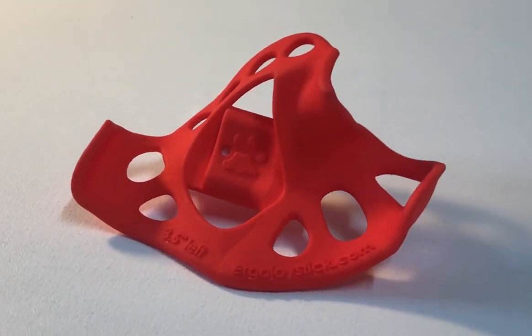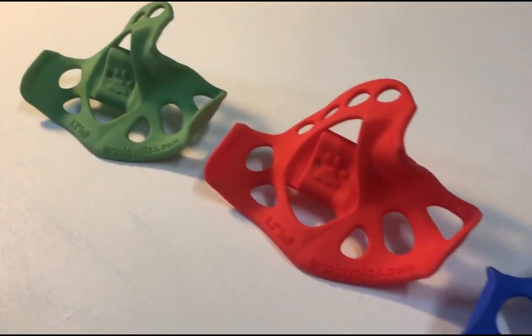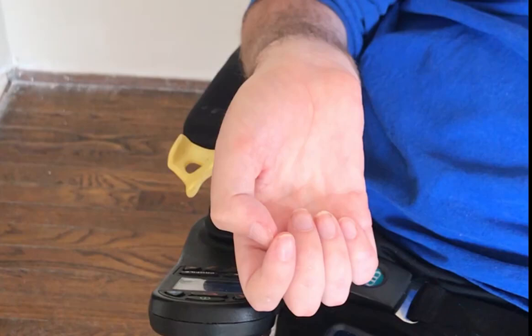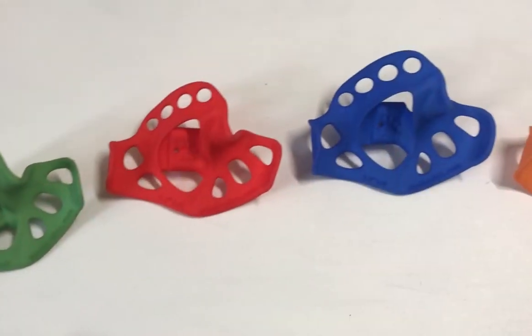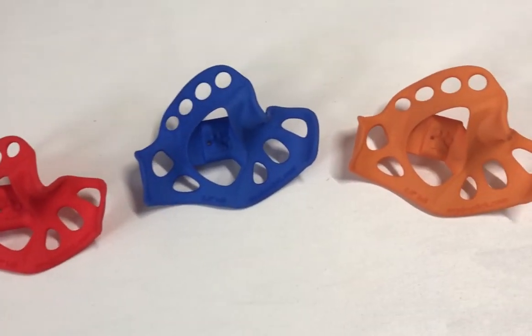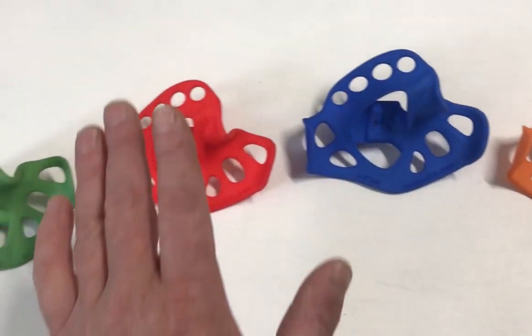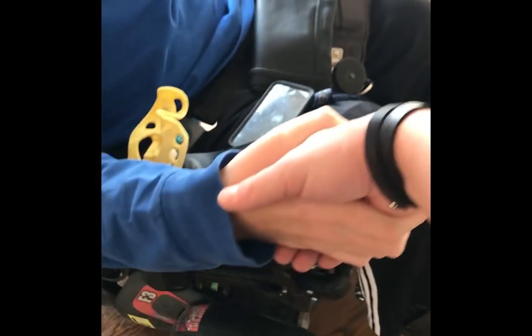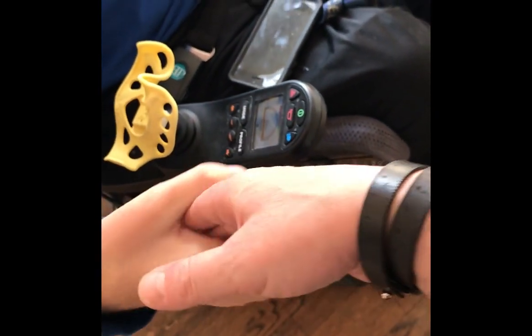Curvy smooth contours and colors like a candy rainbow. Hey, this handle wasn't made for your eyes — it was made for your hand. Coming in a variety of sizes, there will be one that fits you just right. A handle is a handshake, supporting and communicating, like holding hands with a close friend, but a lot less sweaty.